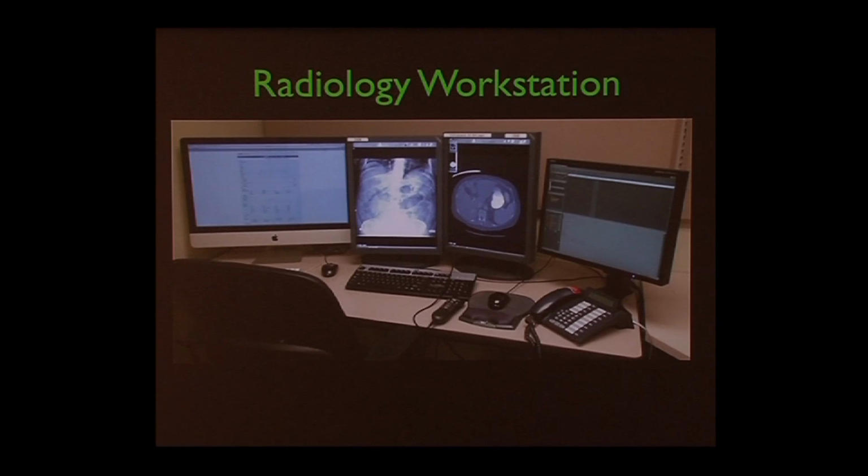I have a screen to actually dictate. So here's my dictation device. And I have a computer, my favorite kind, to search the internet. As Dr. Tabas and I were just discussing before the talk, we might be going on Wikipedia, we might be going on another kind of medical website and doing some research.